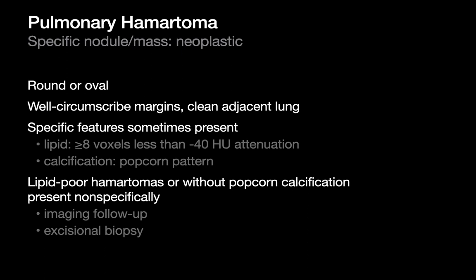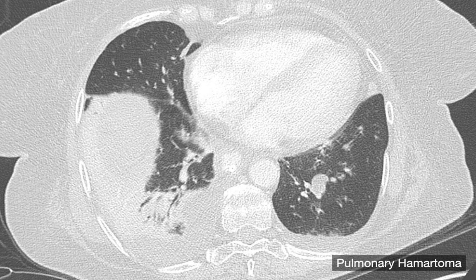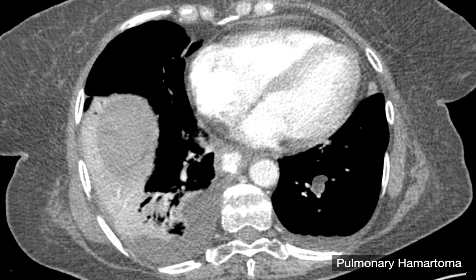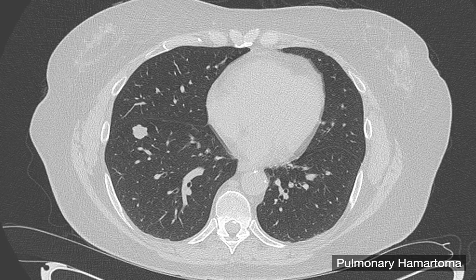Other pulmonary hamartomas may present with a popcorn pattern calcification — that's a specific feature. Not every pulmonary hamartoma is going to present with popcorn calcification or macroscopic fat; those are the ones that will present nonspecifically and get worked up as a nonspecific nodule, sometimes requiring lots of follow-up imaging or even an excisional biopsy. Here's an example of a pulmonary hamartoma — a well-circumscribed ovoid nodule in the left lower lobe. On soft tissue windows, the density of this nodule is equivalent to subcutaneous fat, because this thing is mostly macroscopic fat. A nodule that looks like this is highly specific for pulmonary hamartoma.